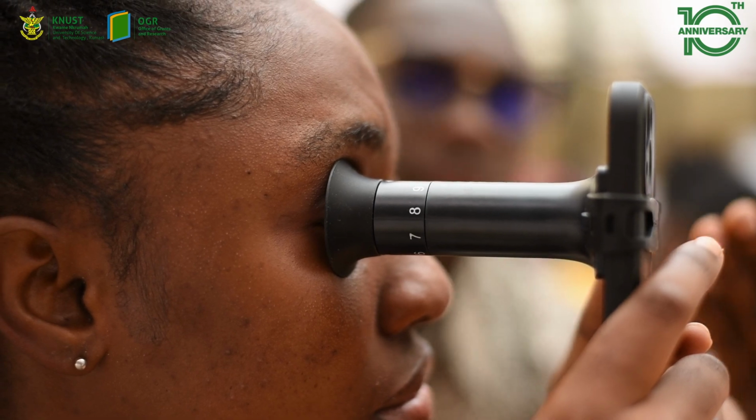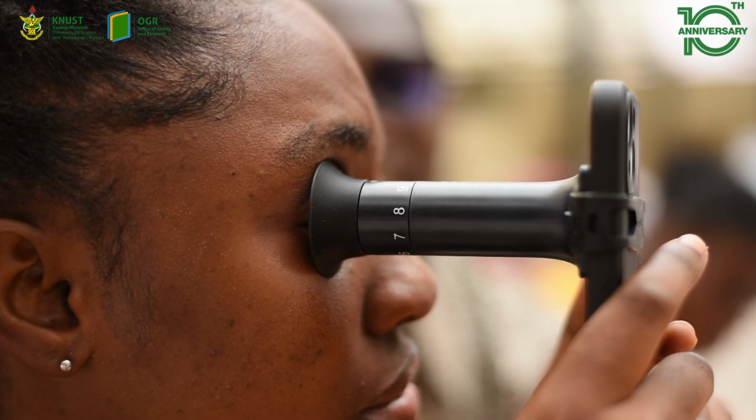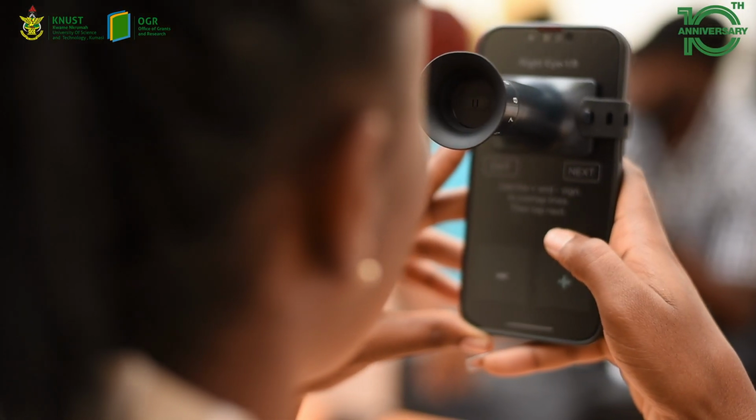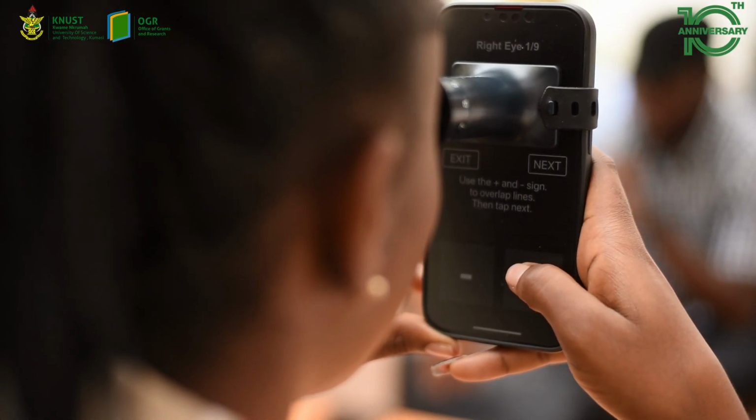Our patient here is self-refracting. The principle is that as she looks through the eyepiece, she's able to adjust the distance between the targets, and as they get closer or far apart, the device estimates the refractive error that she has, and equally estimates the refractive correction that she will need.